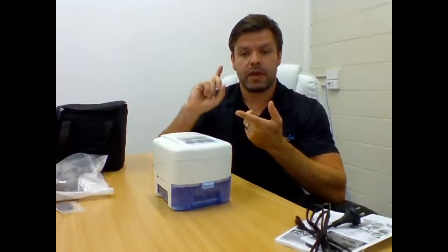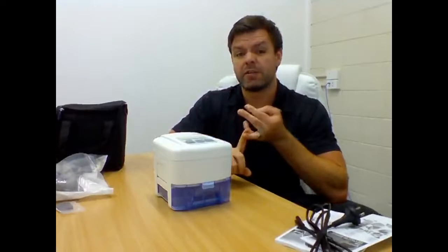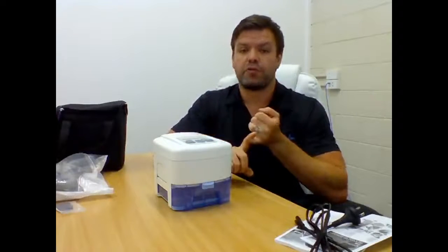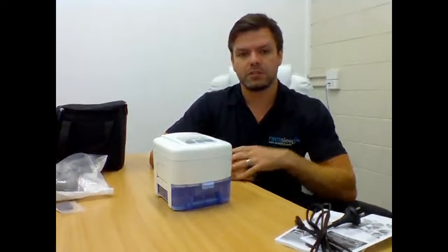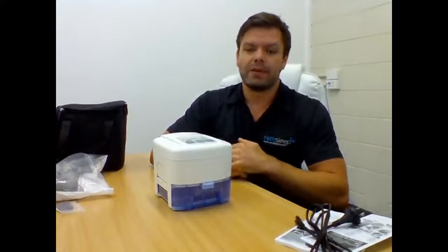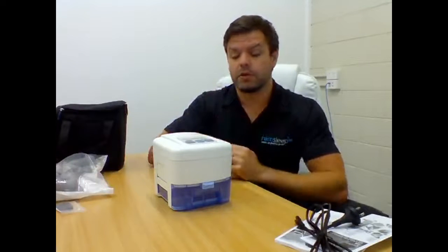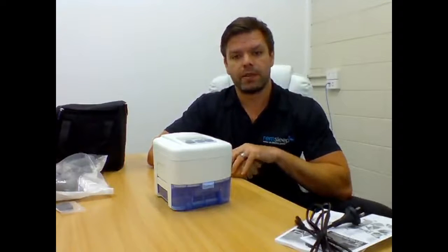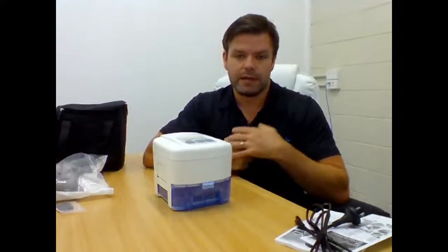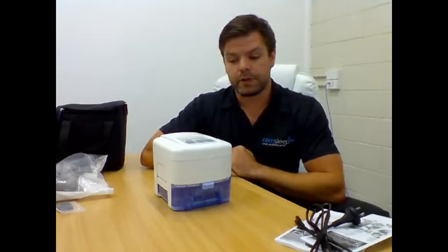It'll have things like your apnea-hypopnea index, how many hours you're using it for, your leak rates for your mask, what the pressure's doing, and just great summary data so you can check out your therapy, make sure that it's doing the job, and then you can also alter your therapy requirements depending on those results. We can also help you with that. If you need to, you can jump on the online chat or give us a call, and we can tell you how to access the data and give you a bit of an idea of what's going on.